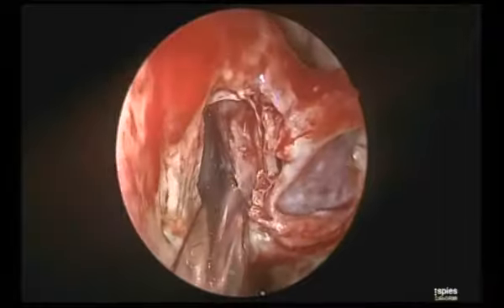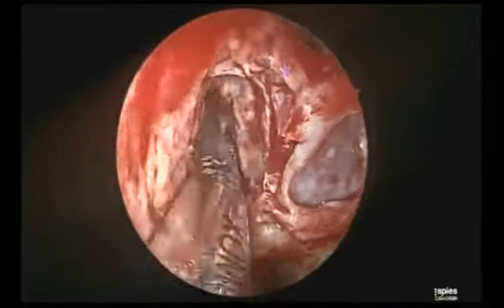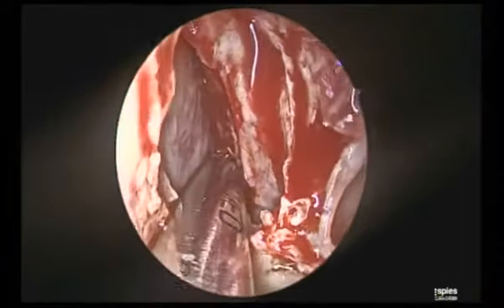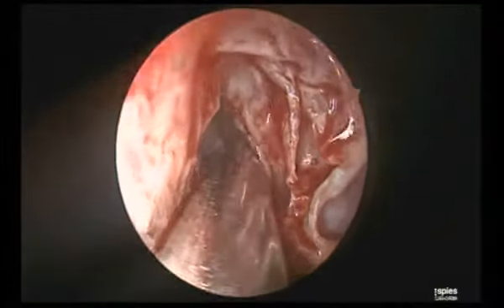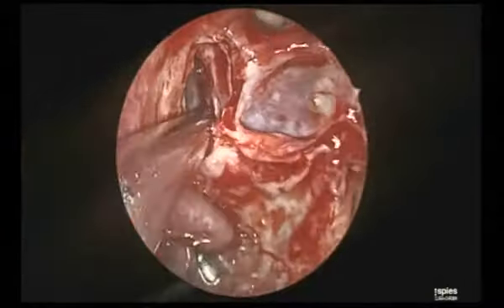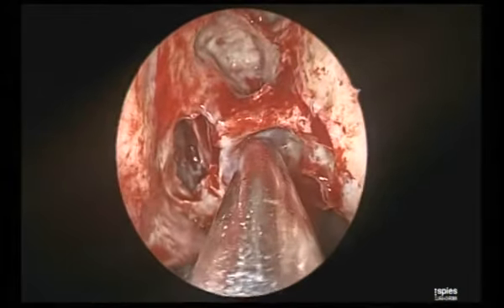I am trimming off the lower one third of the superior turbinate, and see where I am working between the superior turbinate and the septum. This is my nasal septum. So if I trim the lower one third of the superior turbinate and go in the sphenoethmoidal recess, see that what I am wanting before doing posterior ethmoidectomy. These posterior ethmoids are intact.